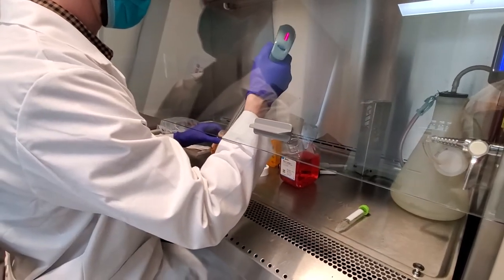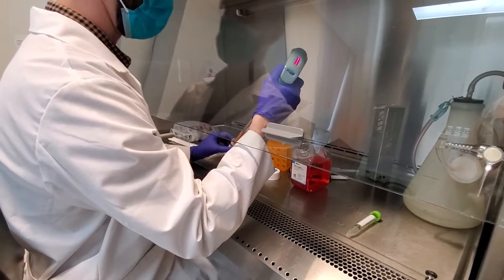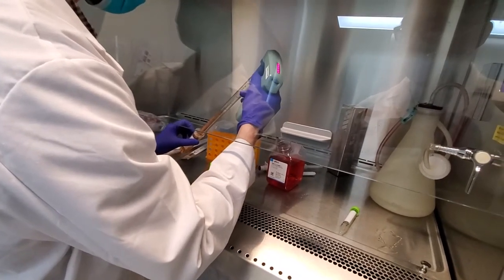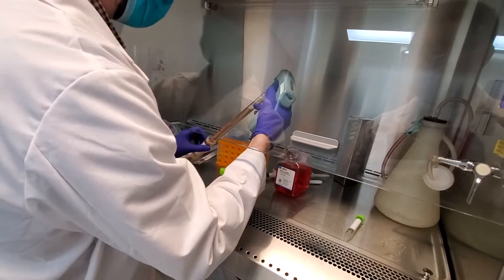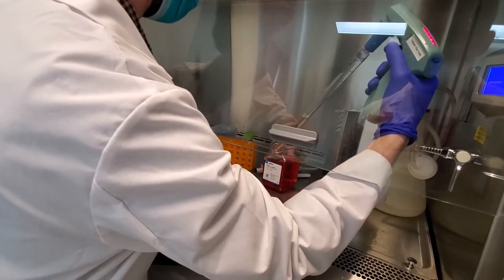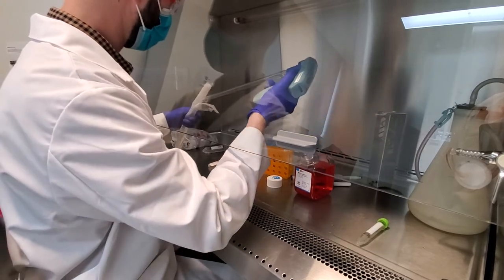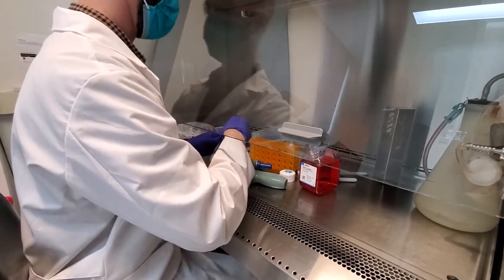All right, so theoretically you could just tip this tube over into there, but to avoid getting whatever might be on the outside of the cap onto the inside of the bottle, I'm going to transfer by pipette. If I want to reuse this pipette, I very carefully thread it back into the packaging there. Alright, so now we're going to do FBS.